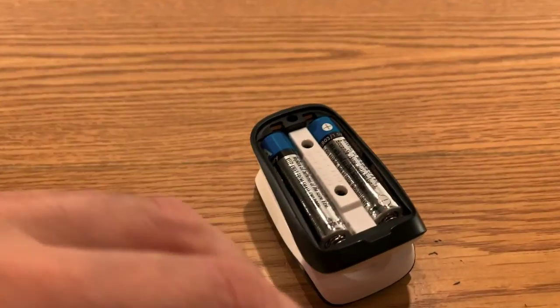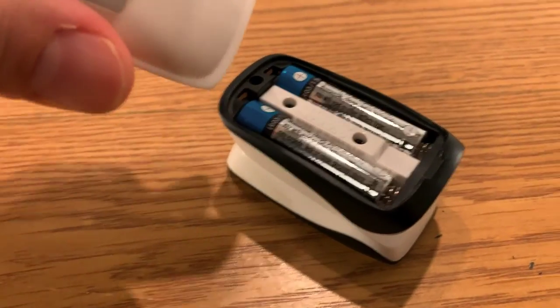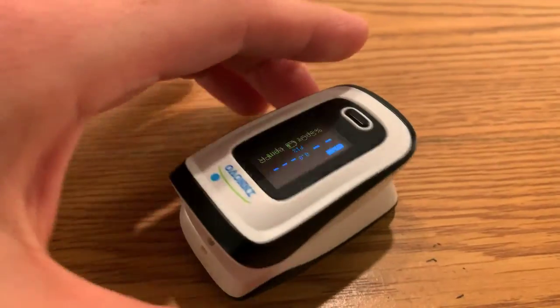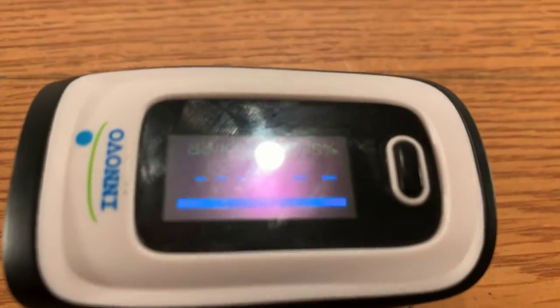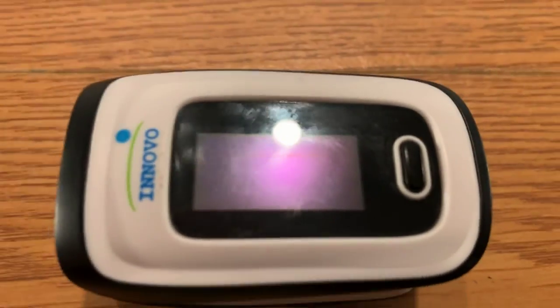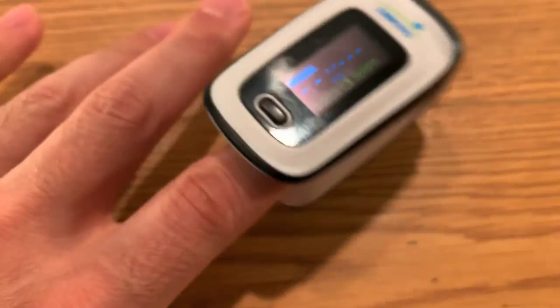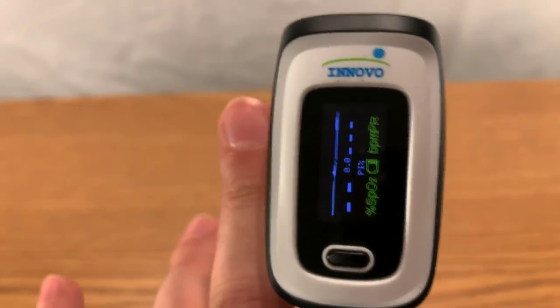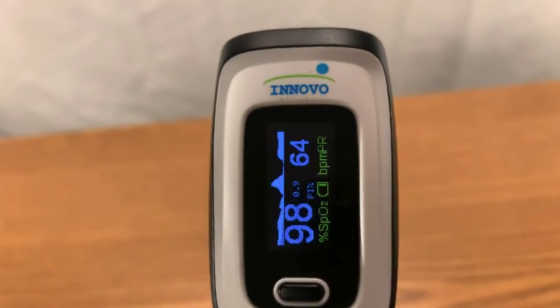Just to walk you through it quickly — the back comes up, and it takes two triple-A batteries. Let me put this back on. I think the screen timeout can be adjusted in settings. Let's see what happens when you stick your finger inside — it's been a while since I used this.